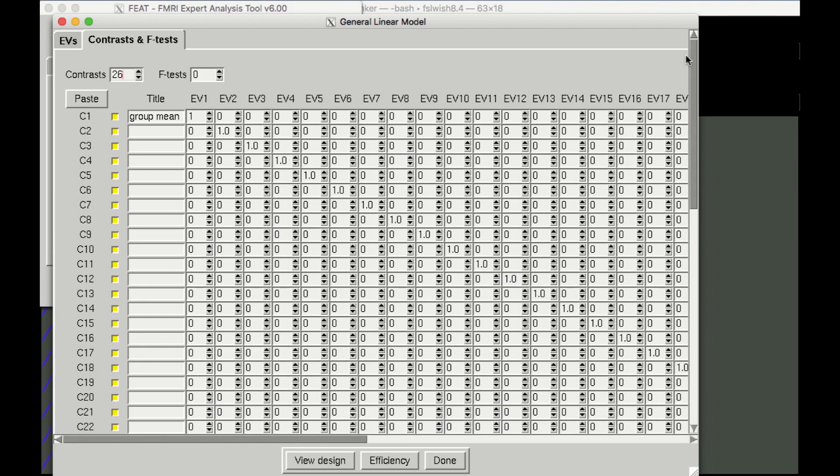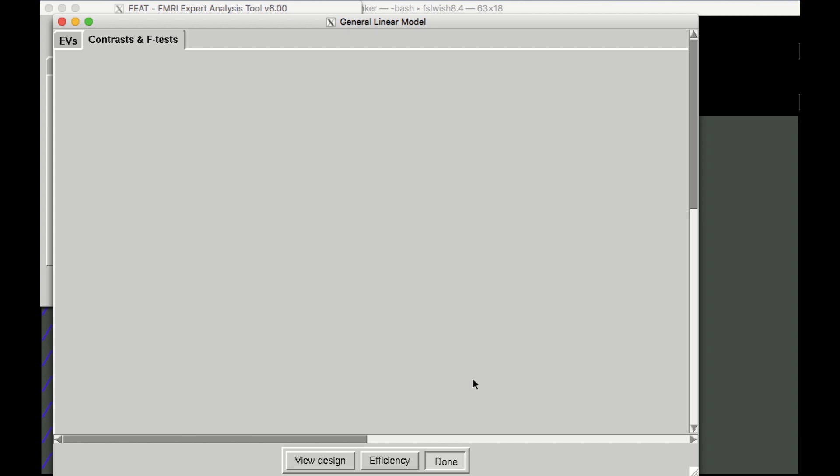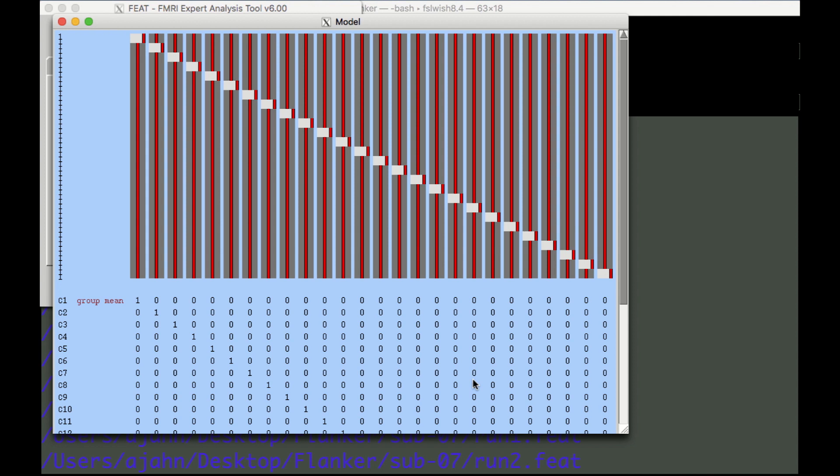When you've filled in all the numbers, click the Done button to see the design matrix. Here, check to make sure that the gray boxes are on the diagonal, and that the contrast weights down below are a straight diagonal of 1s.